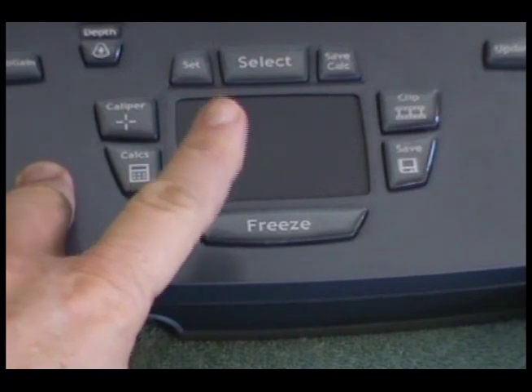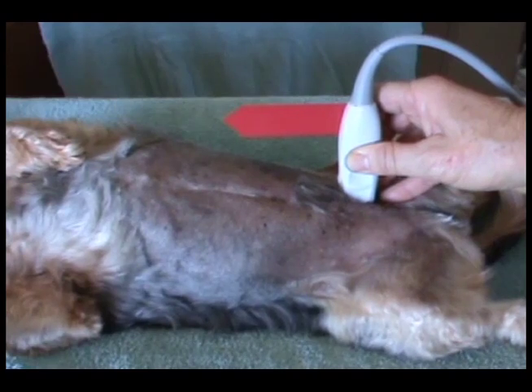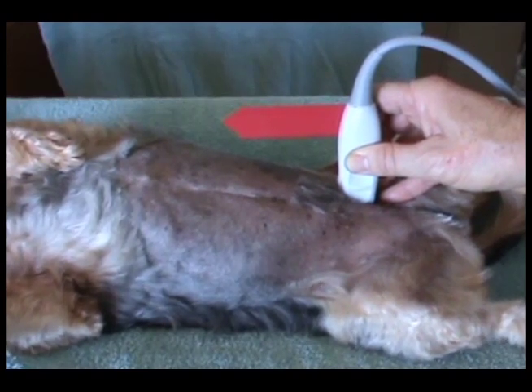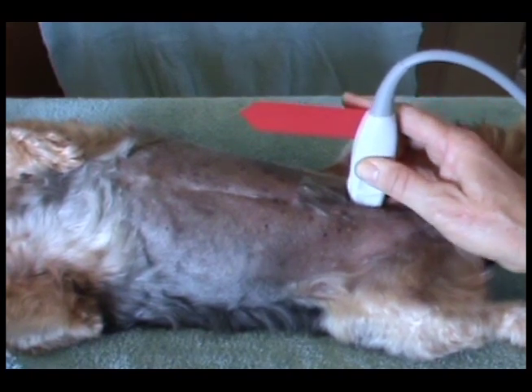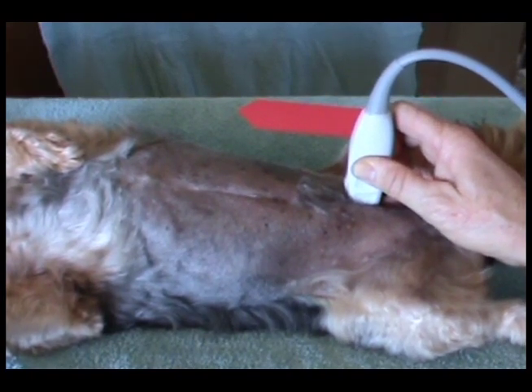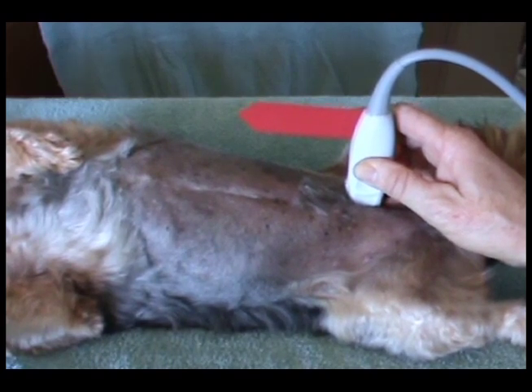Remember to keep one finger of the keyboard hand on the freeze button ready to capture the best image. When you press the freeze button, practice leaving your transducer hand relaxed and in position so that when you unfreeze you will still have the same image. This will save you time and effort.